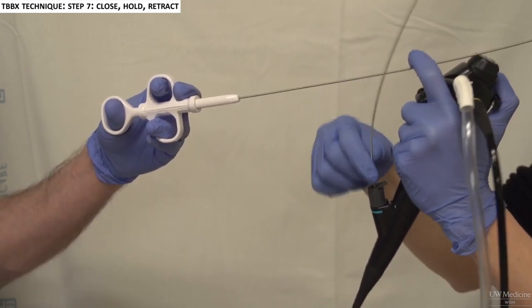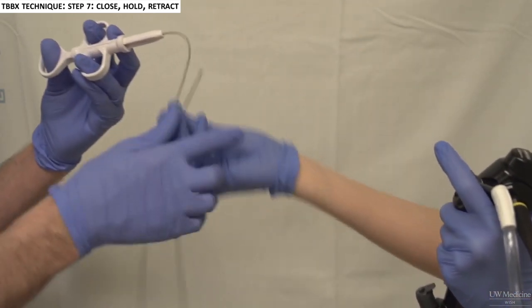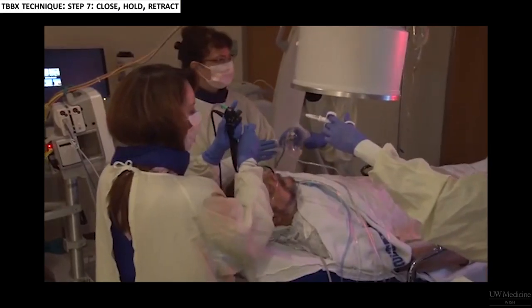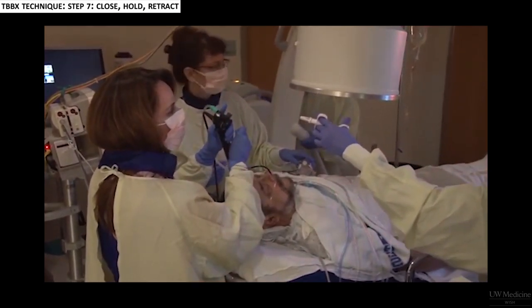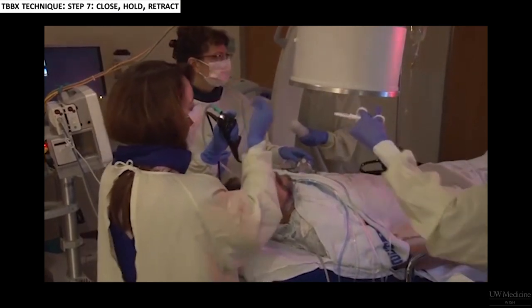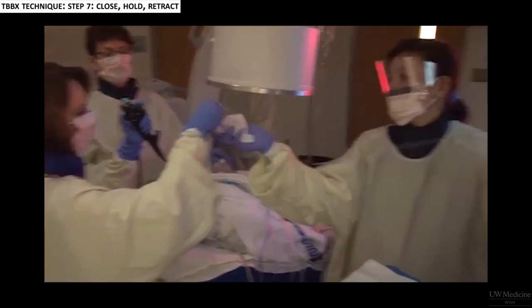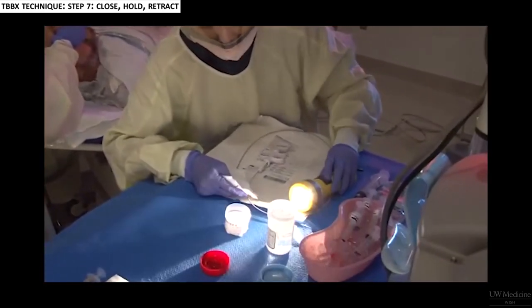If they do indicate they have chest pain, you should be concerned that the forceps are cutting pleura and let go of the sample. When retracting the forceps, it is normal to feel a small tug as the sample is removed from the lung. However, if you find yourself really pulling to retract the forceps, you should let go of the sample by opening the forceps. It takes experience to differentiate a normal tug from too much resistance.